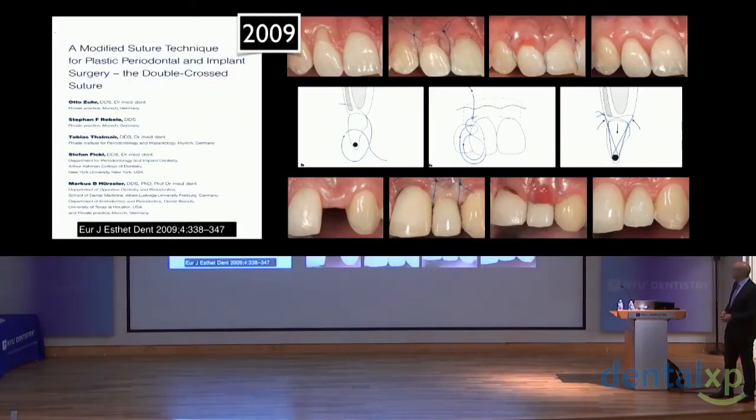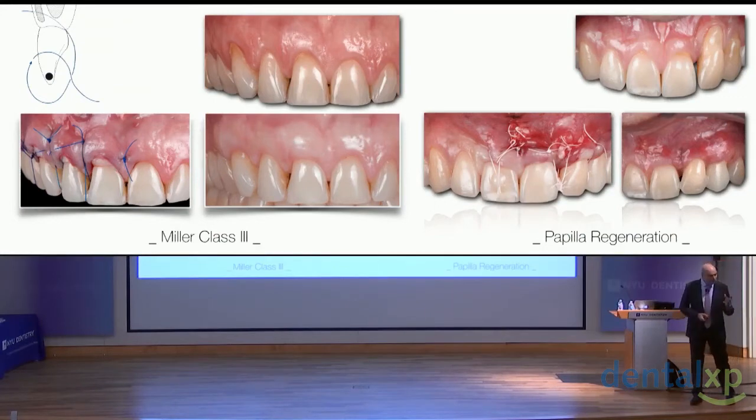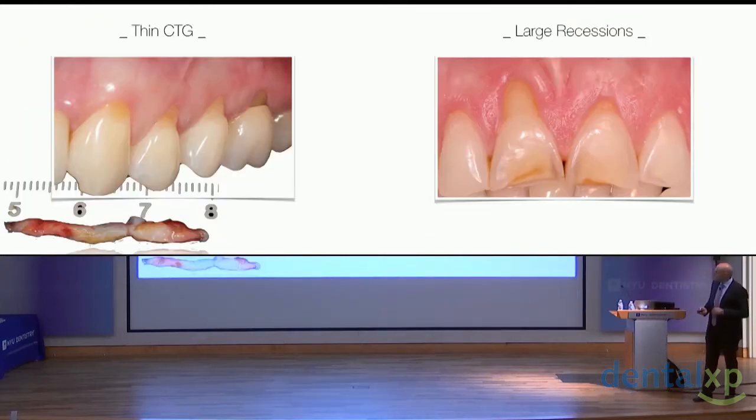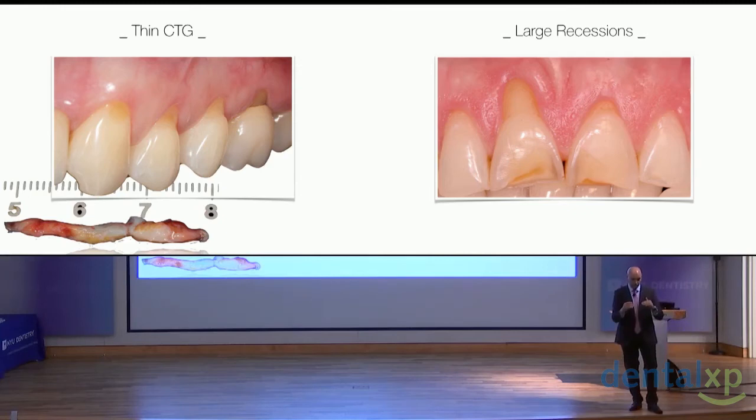This is the result. And this was published in 2009. I used those sutures in Miller class 3 and papillary regeneration in less predictable cases, but not always. You may use them when the connective tissue graft is very thin, or you are approaching a large recession. Very useful in order to cover most of the connective tissue graft.